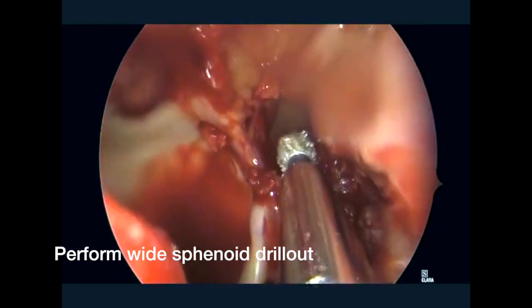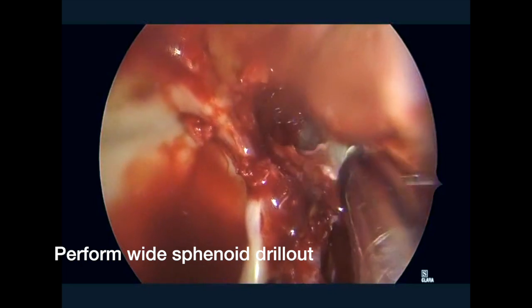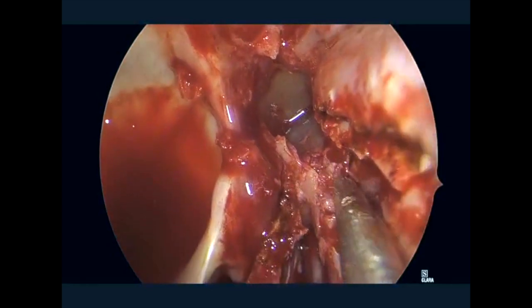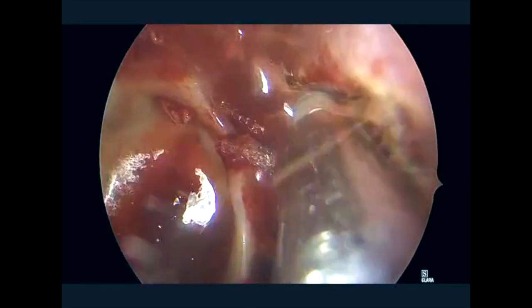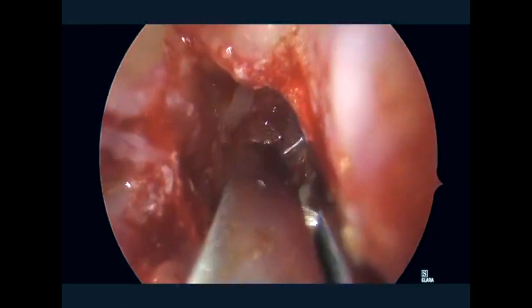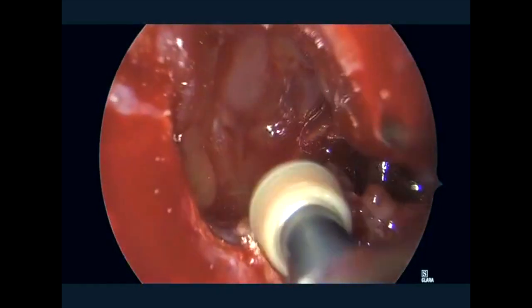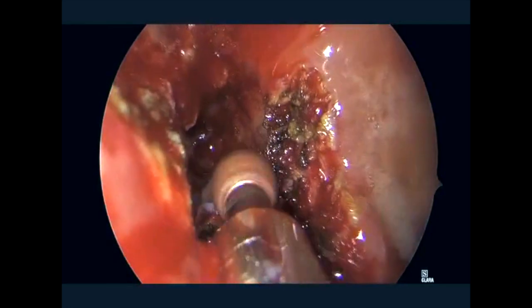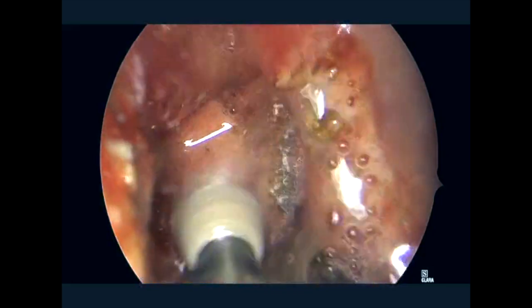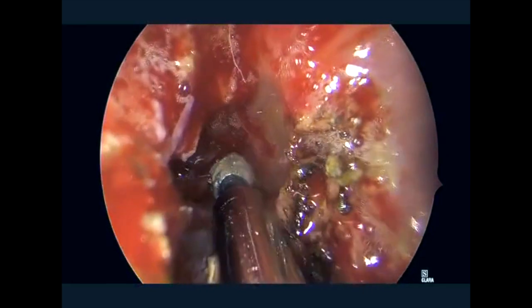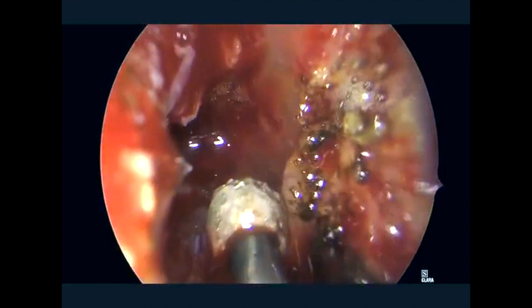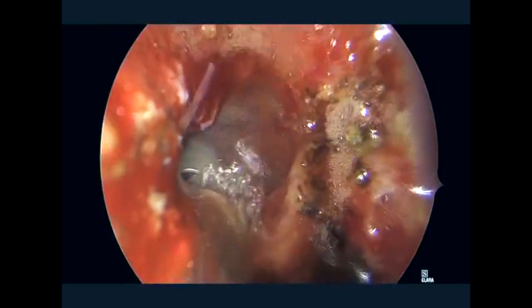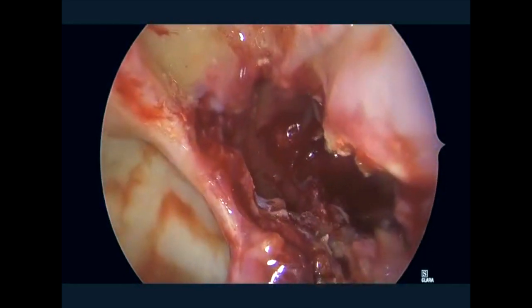We use a choanal atresia burr to drill down the sphenoid rostrum and the keel of the rostrum. Oftentimes in these cases this is quite osteitic, and therefore the drill can be a helpful instrument to ensure a wide opening taken between the two sphenoidotomies to ensure a common cavity, similar to a pituitary approach. It's thought that this exposed bone contributes to postoperative scarring — the osteitic abnormal bone induces a more robust scarring reaction. Therefore, this is the bone we're attempting to cover with fresh, non-diseased mucosa from the septum in order to aid with better healing and disease control.